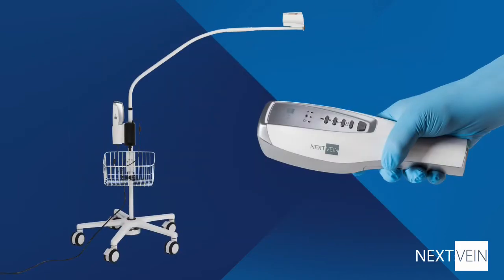Let's start by getting to know the system. There are two parts: the handheld vein finder and an optional hands-free stand. Using it as a handheld allows you to rapidly assess the patient, and the hands-free stand allows you to quickly free up both hands to perform the cannulation procedure.